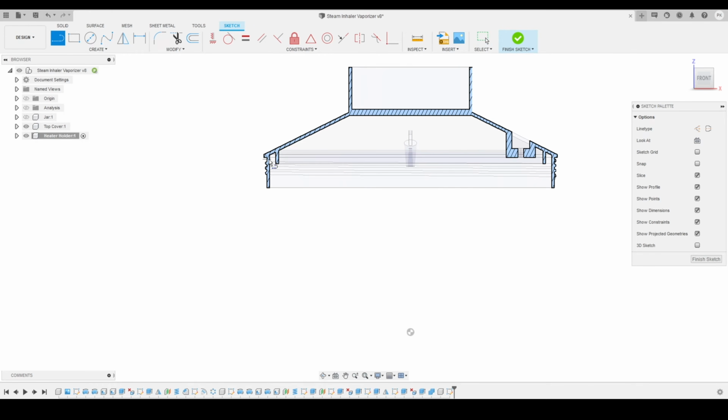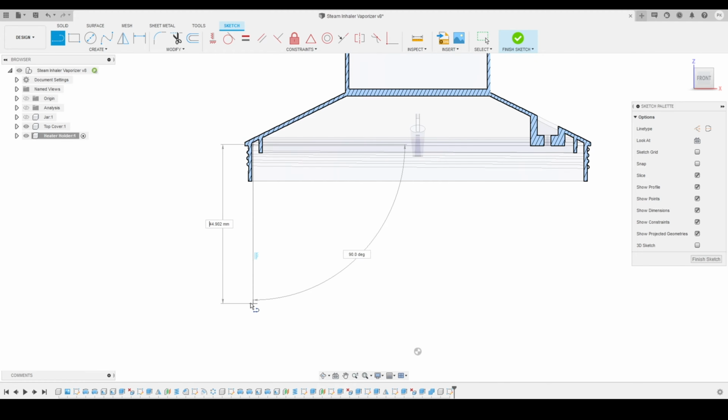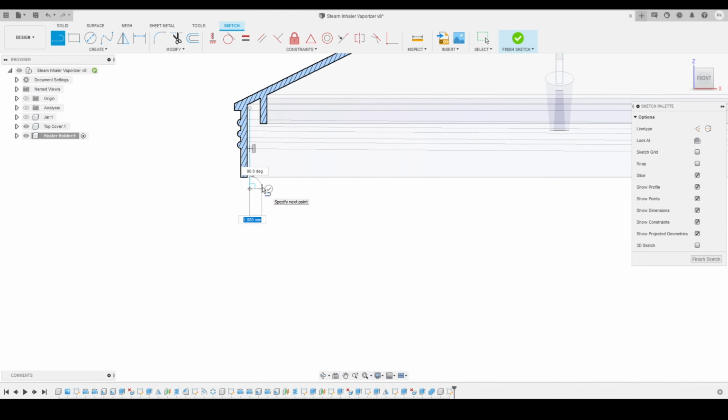I will start sketching using the line tools. I'm going to skip this portion a little bit because I'm going to do a fast sketch over here. I don't want to waste your time. If you want to learn more about sketching, refer to our other videos where I had explained everything about sketching.